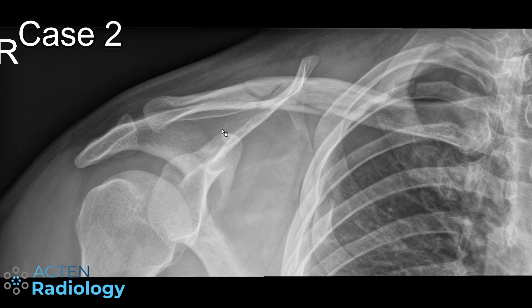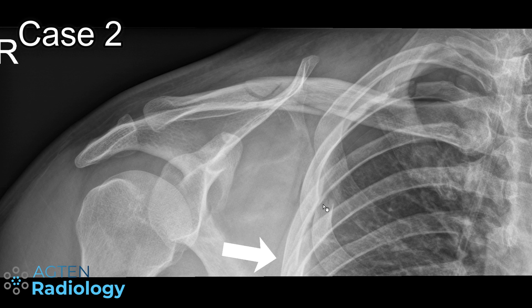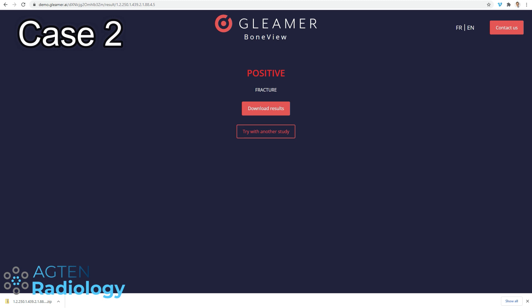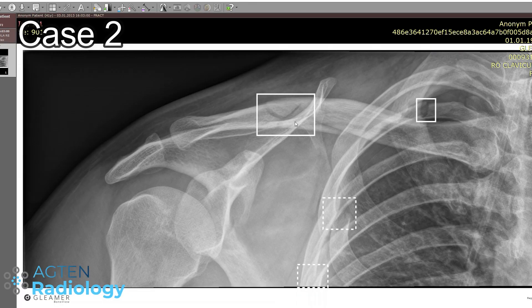The next case shows a clavicular fracture at the middle third, but there's also a rib fracture — the third rib — and possibly more rib fractures. This is a really interesting case because as a human you might overlook many things when there's so much going on. After pressing analyze, this is quite impressive: the algorithm detected the clavicular fracture, it detected the rib fractures here, there, and there. It didn't detect the pneumothorax, but it's obviously not trained for that. I was not expecting the algorithm to detect all these fractures.